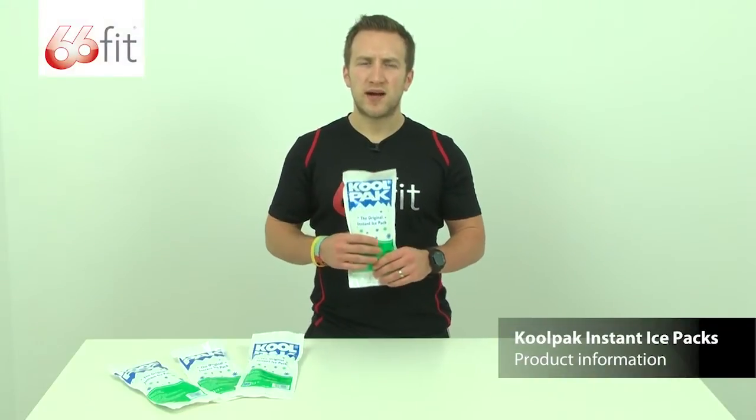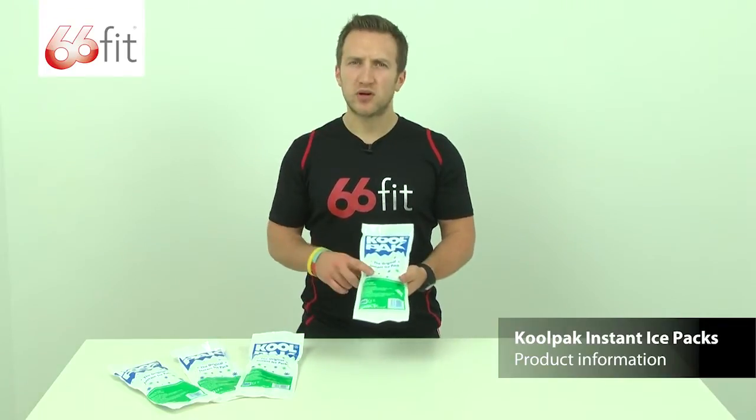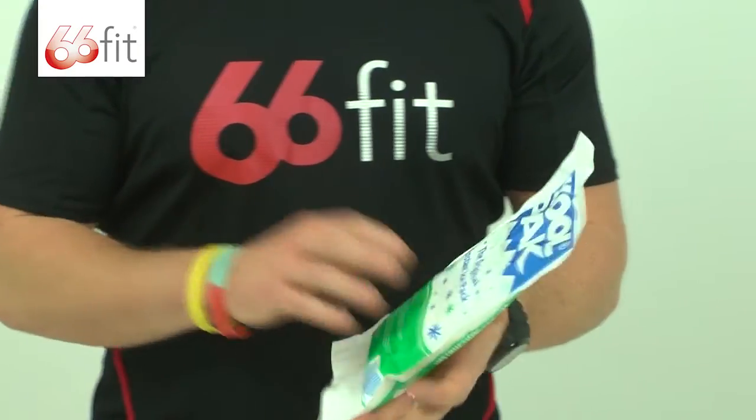These are the Coolpack Instant Ice Packs provided by physiosupplies.com. They come provided in a box of 20 and they're great for relieving pain and swelling following soft tissue injuries.